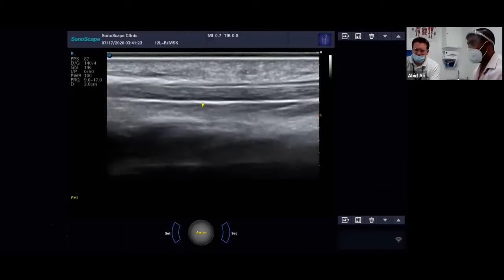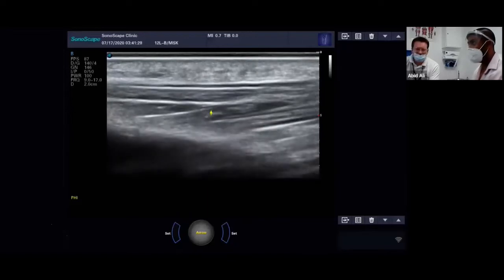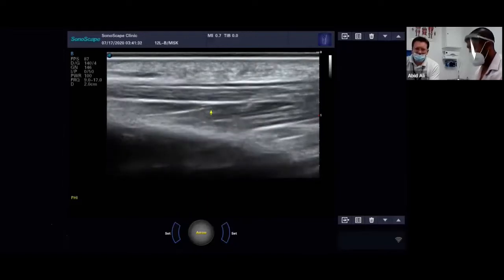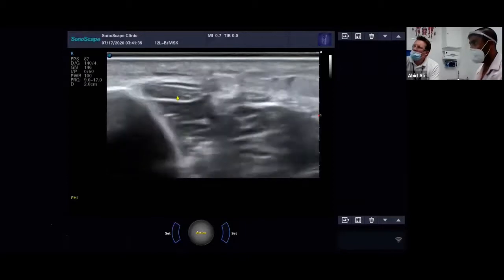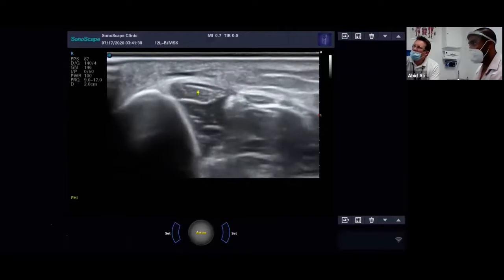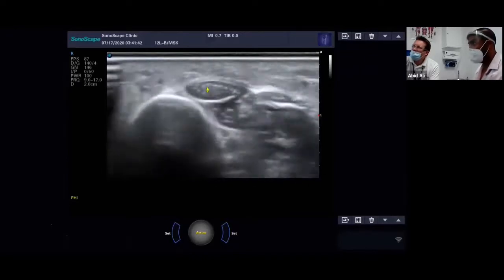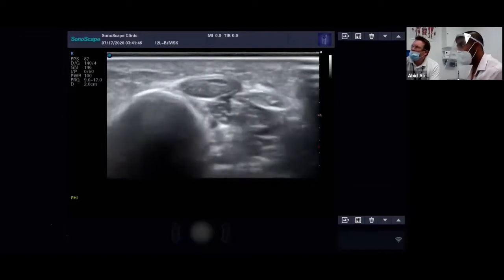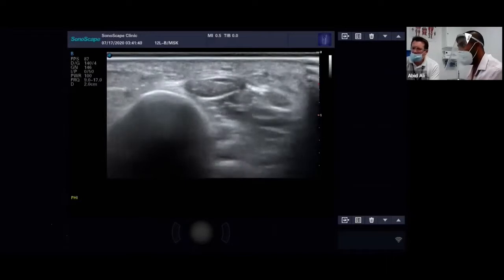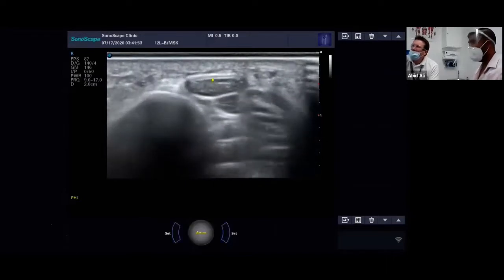So of course, we're not going to just look at this tendon, and this applies to every tendon. We're not just going to look at this tendon in long section. We're now going to go into transverse section. So keeping the tendon in the middle, I'm simply going to spin my probe. We'll keep the tendon in the middle. And now we're going to follow our tracks back down. The trick being to keep the tendon in the middle of the screen. And we're looking at the internal fibers. We're looking at the halo. That should be about 1 to 2 millimeters maybe in thickness.